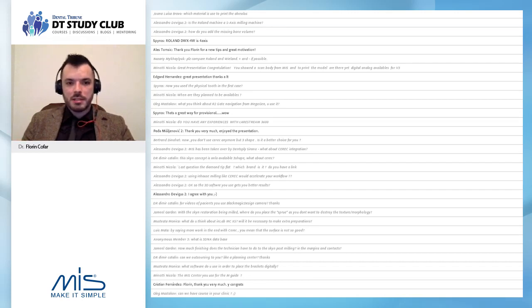If the restoration is thin and you place it on the proximal, you will have vibration and it is very likely to break. So if you have a thin restoration, you place it on the cervical, because the emergence profile usually has little texture and it's unnoticeable as you remove it and finish it. So yes, cervical if it's thin, proximal if it's thick.